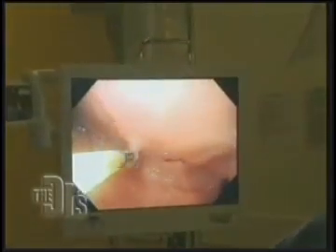Okay, so now we're in the small intestine, and we're going to take some samples to make sure he doesn't have a bacteria. Open, close. That's what a biopsy is like. The patient doesn't feel that at all, because there are no nerve endings really on the inside of the stomach.